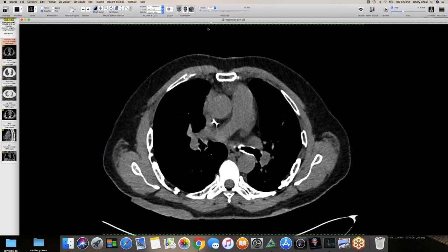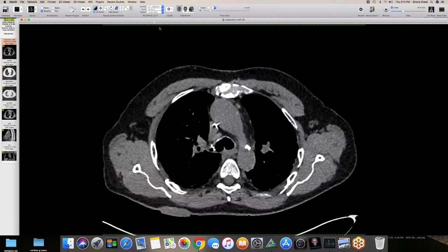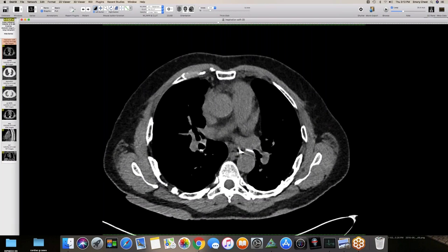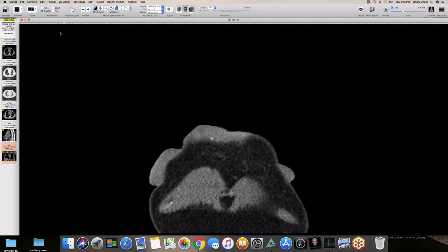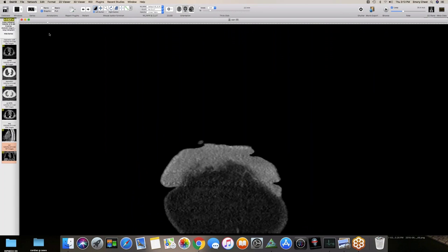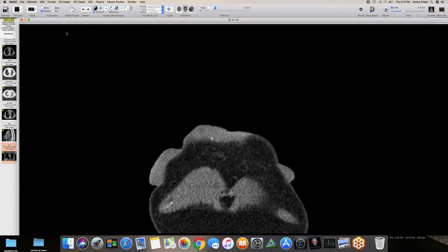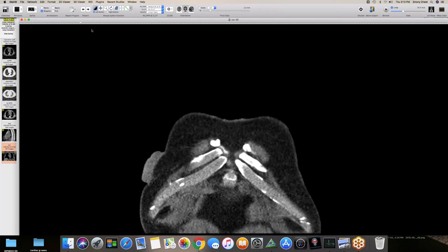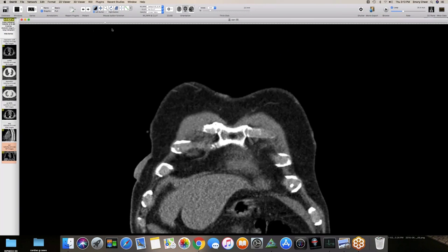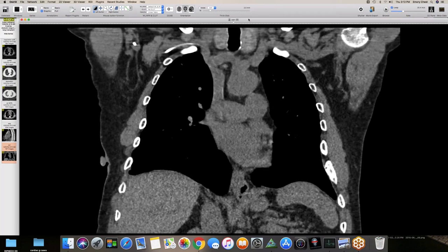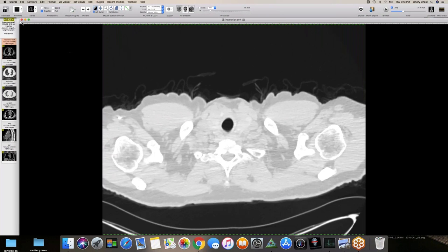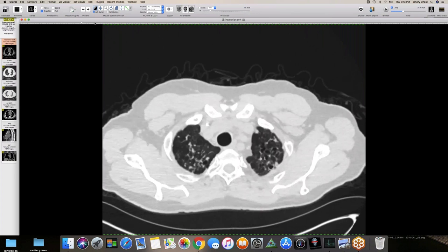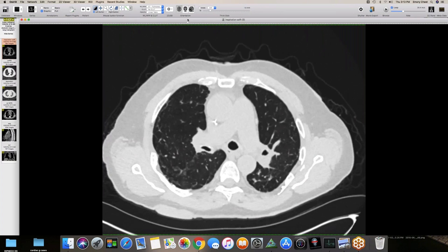The stuff in the anterior chest wall looks like a perfect distribution for a clamshell thoracotomy. And another interesting finding: looking back at the lung windows, this patient has more of a restrictive allograft appearance, with what looks like early pleural parenchymal fibroelastosis going on up top.